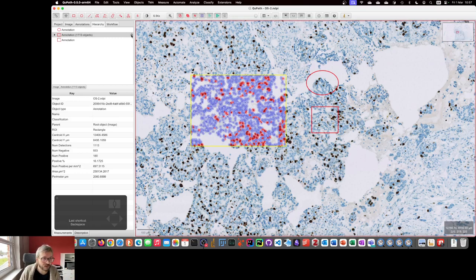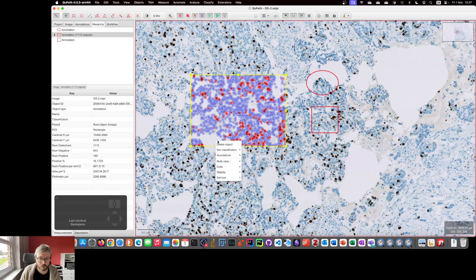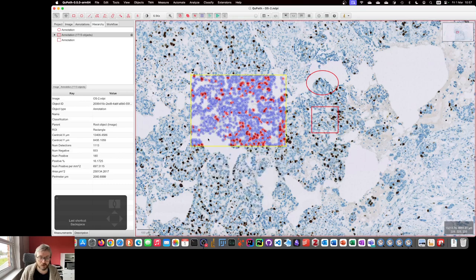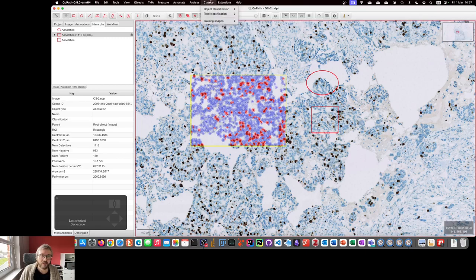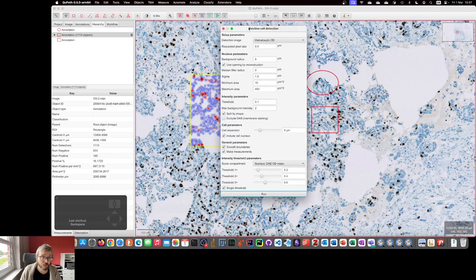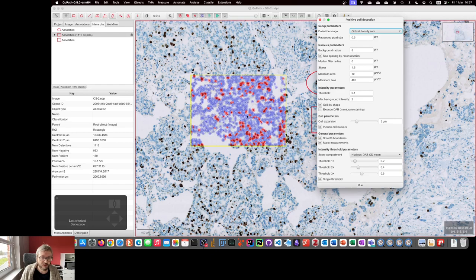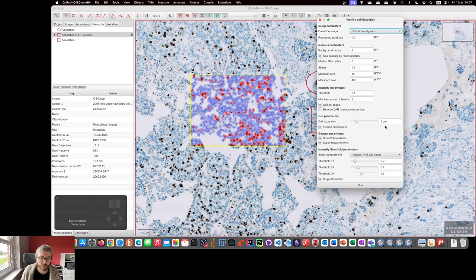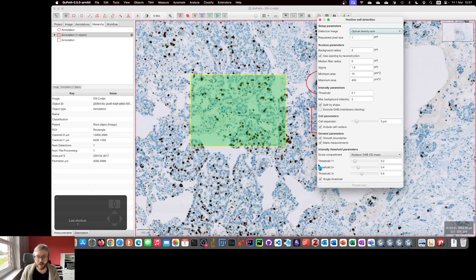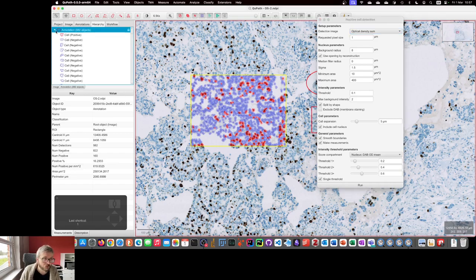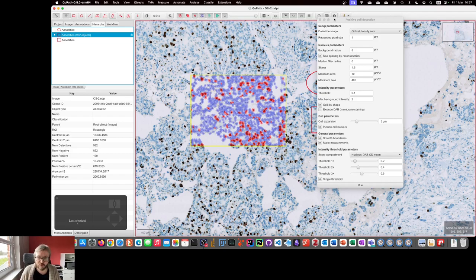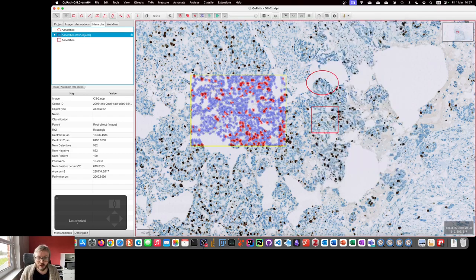Incidentally, little padlock is showing that we have the annotation is locked. Whenever I unlock it, little padlock disappears. So the hierarchy tab is really useful to keep on track of what is going on. The last thing that I then want to say about that. Consistent with the thought that QPath will try and do something sensible most of the time, is if we have this hierarchy relationship, I haven't unlocked it, I haven't edited, I run cell detection again, QPath will delete everything inside and then create the new cell. So there's no double counting here. So, most of the time, you shouldn't have to worry about this.